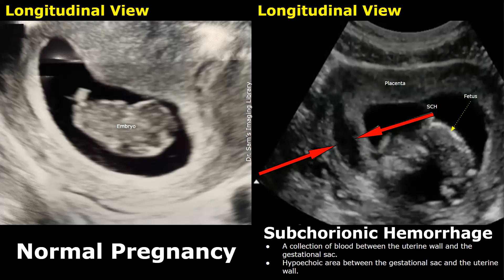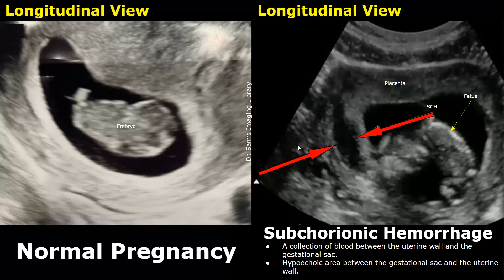Hello everyone, this is Dr. Sam and today we will look at subchorionic hemorrhage on ultrasound. Subchorionic hemorrhage refers to bleeding outside the gestational sac. Blood accumulates between the chorion and the uterine wall. We will compare the ultrasound appearance of a normal pregnancy with the appearance of subchorionic hemorrhage.